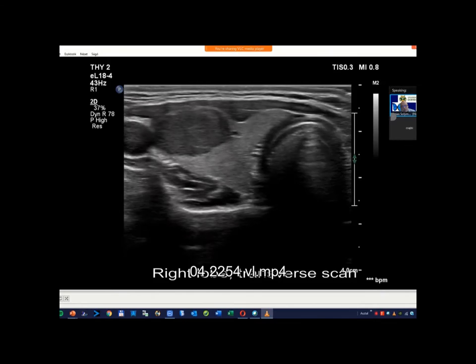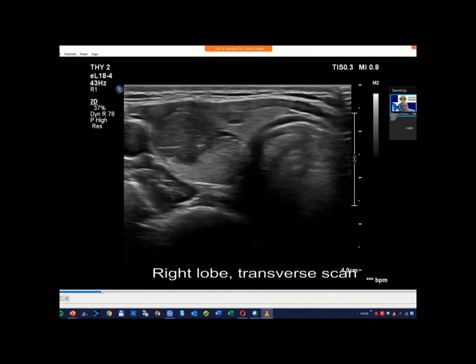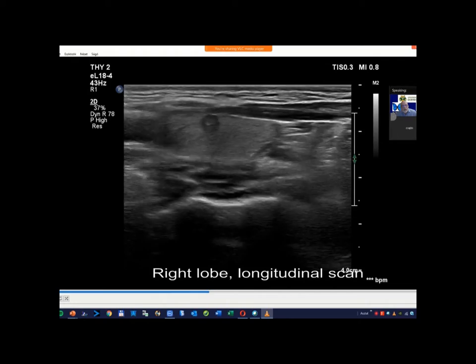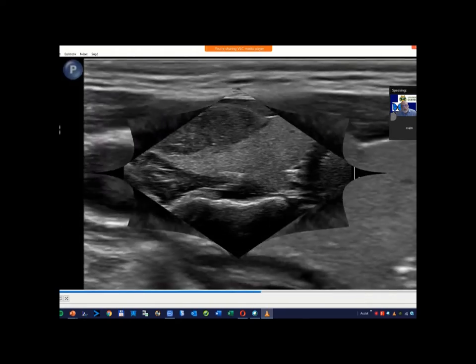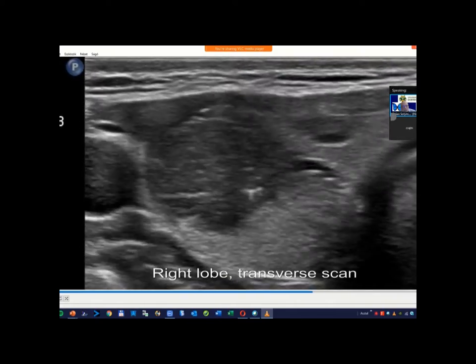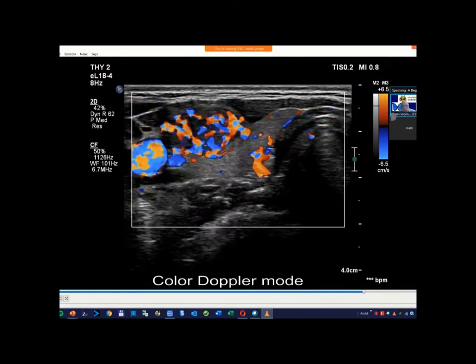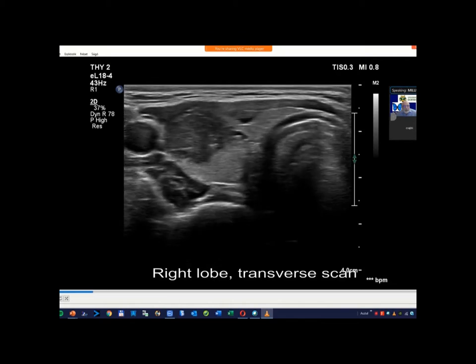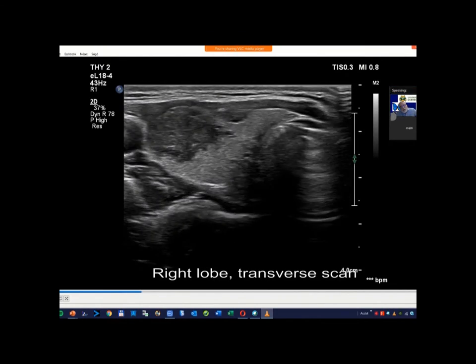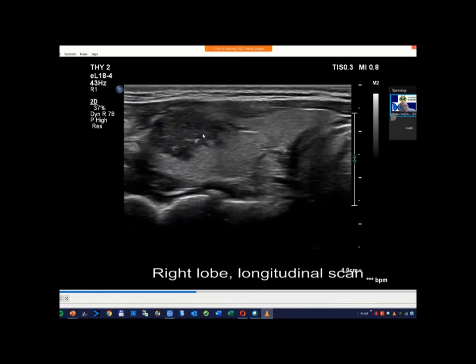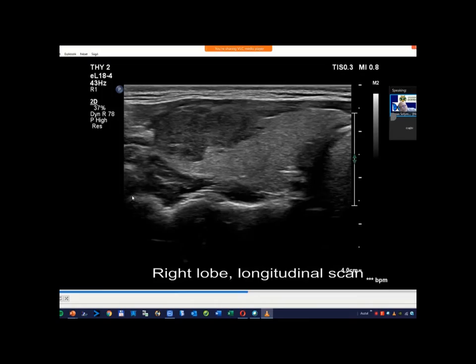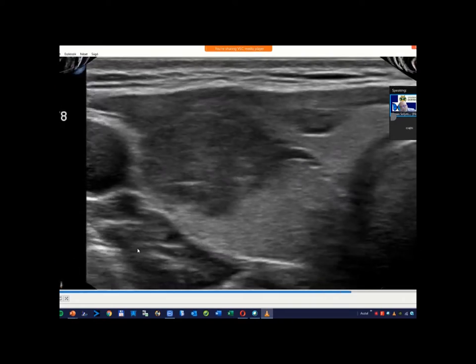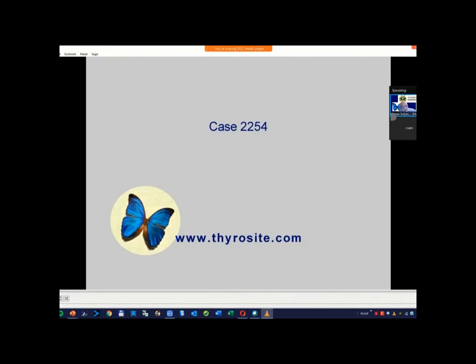The first question is how to interpret the intranodular echogenic figures in this case. I think that granular forms prevail over linear forms, and the overall impression of this nodule is that these figures can be microcalcifications. In contrast with the former case when the granular and linear forms were in the same proportion, in this case granular forms prevail.